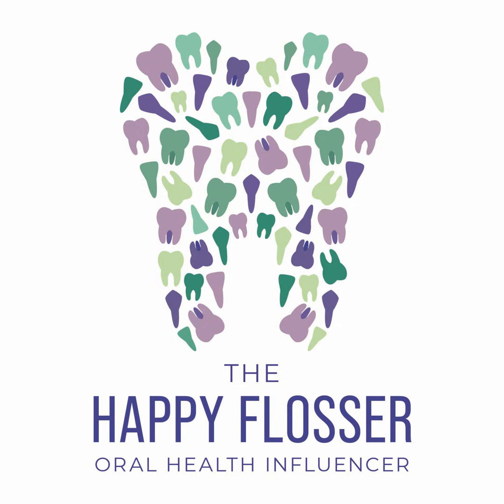Those early detectors is what I'm talking about. So thinking about some of the benefits of the radiographs in periodontal evaluation is that some conditions can be seen early. Early bone changes, like I said, that horizontal or vertical bone loss, some of the alveolar bone loss in those furcation areas, you can detect that first on a radiograph, depending on the image. Some bone defects or significant root concavities can certainly be detected on a radiograph.